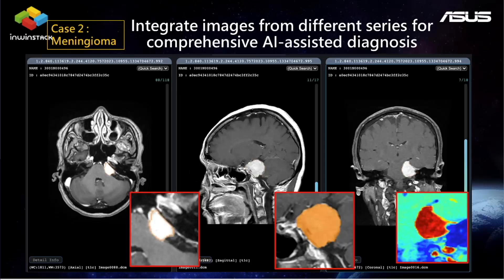Here's another case for meningioma. We want to use this case to explain how important it is for the model to integrate images from different series. Sometimes it's very difficult to recognize meningioma in the axial view, so we have to reference different planes such as the coronal view or sagittal view at the same time. We also do some color enhancement to help the model recognize the meningioma.